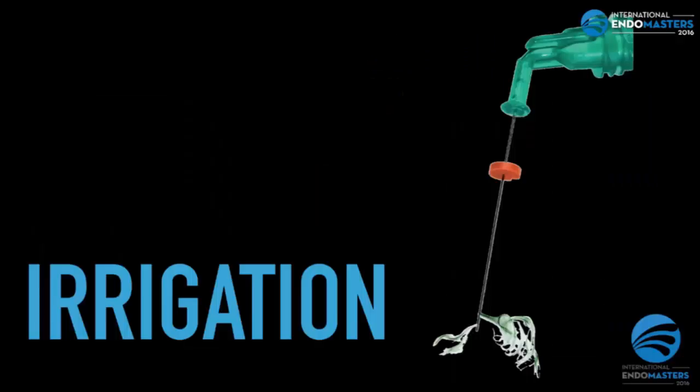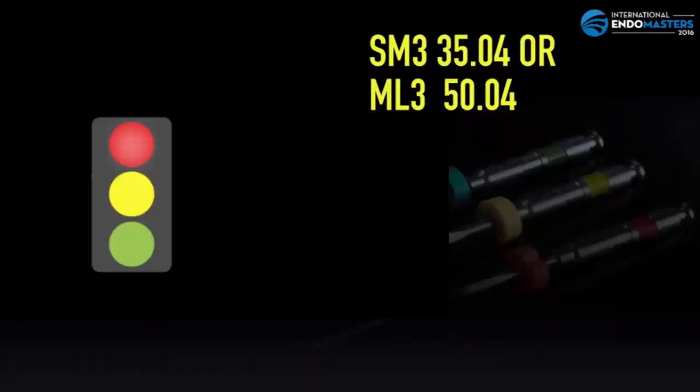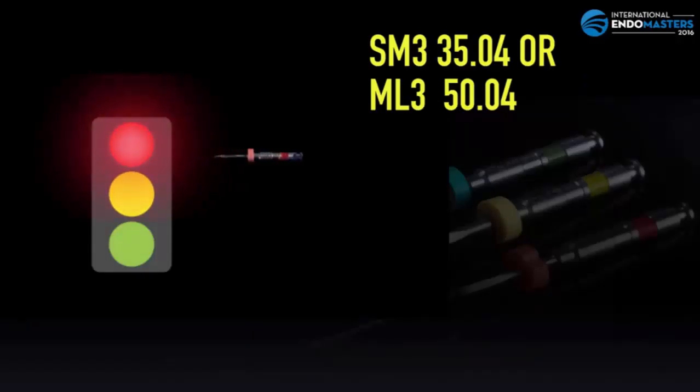Then we use the irrigation again. We confirm the glide path with the K file number 15. And finally, we arrive to the red light. The red light indicates you need to stop.